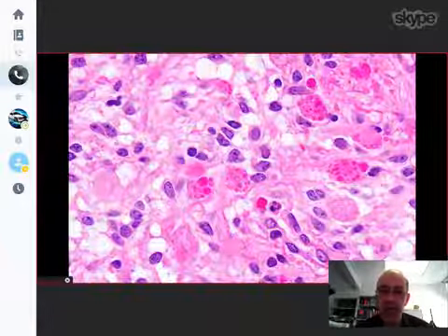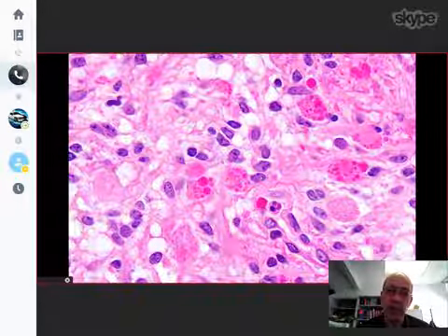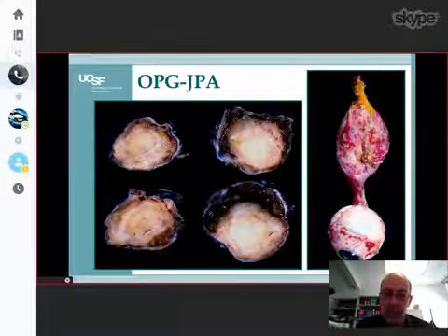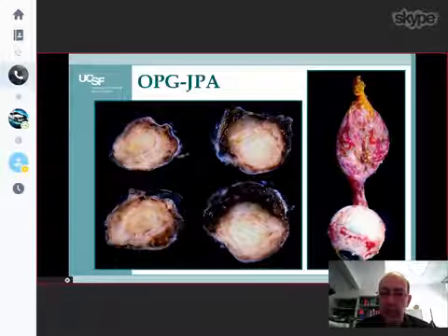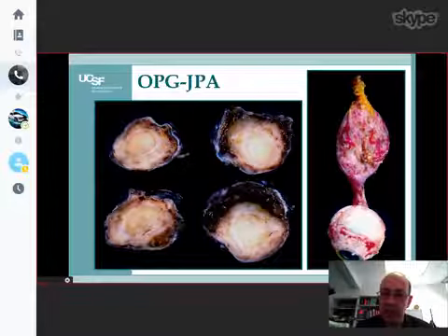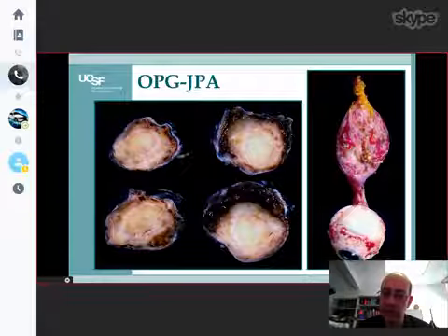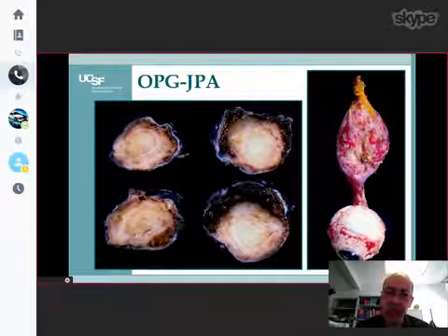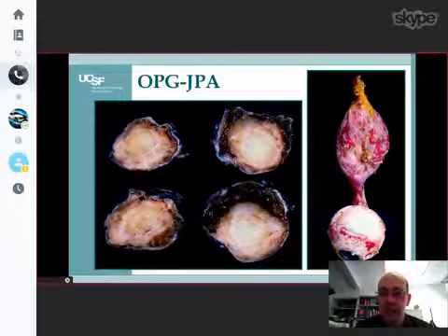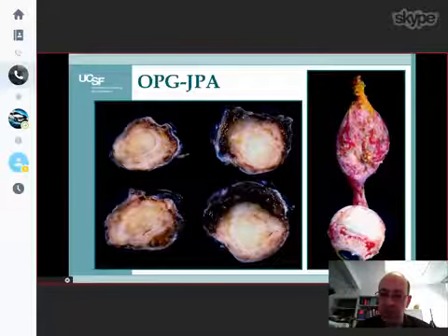Anytime we see either EGBs or Rosenthal fibers, we always think this is a slow-growing, low-grade process, and that's very helpful. In the optic pathway, some of these turn out to be in NF1 patients and in the brainstem as well. But these actually can be stable over time, or they can even regress over time. In a small percentage of the cases where they're aggressive enough that patients lose vision completely, like in this case, they may do a resection or at least a biopsy.